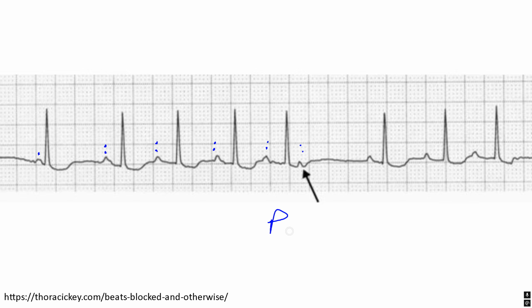This is a premature atrial contraction that is blocked, a PAC. This is not a heart block. This is not atrial fibrillation. Blocked PACs are most often overcalled as these things. Be smarter than everybody else.